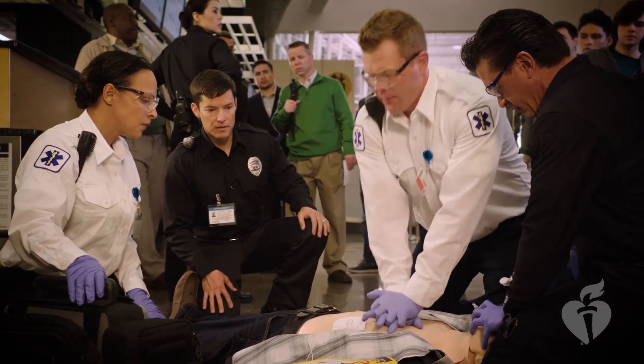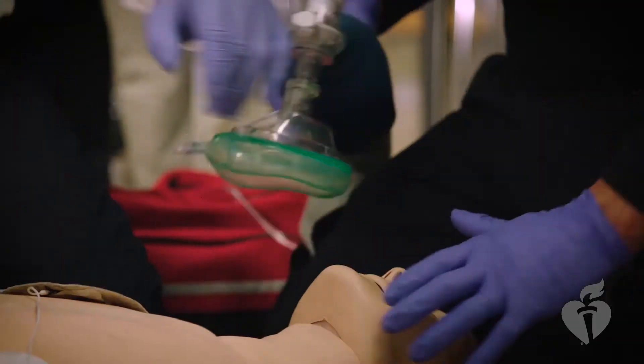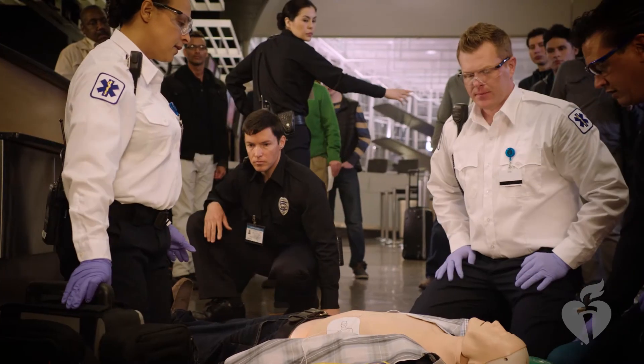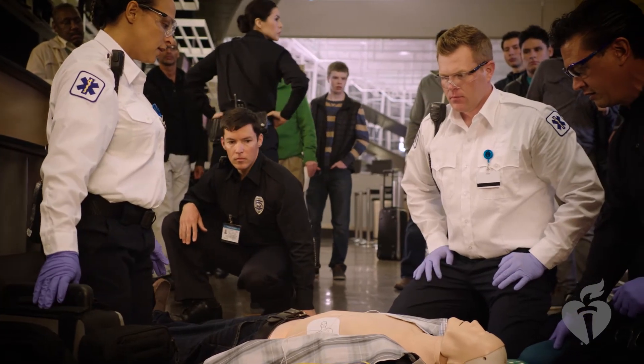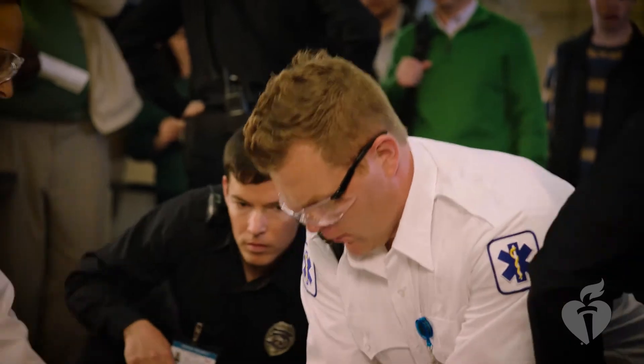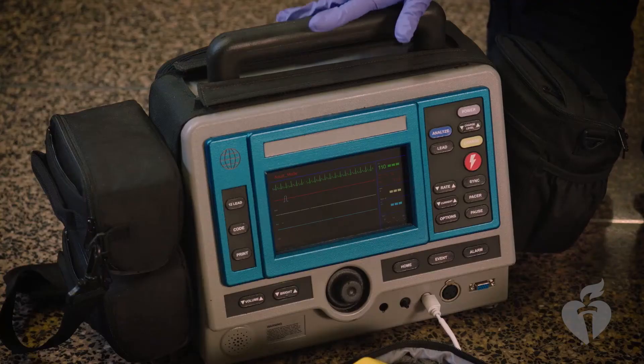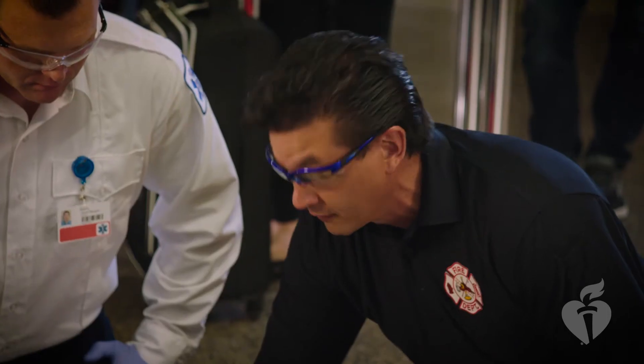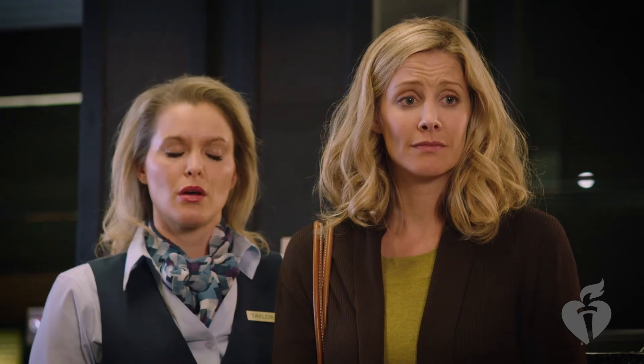Analyzing rhythm. Do not touch victim. All right, back up. Clear the victim for analysis. No shock advised. Resume chest compressions. Wait — he just moved. We've got an organized rhythm. I have a pulse. He's breathing.